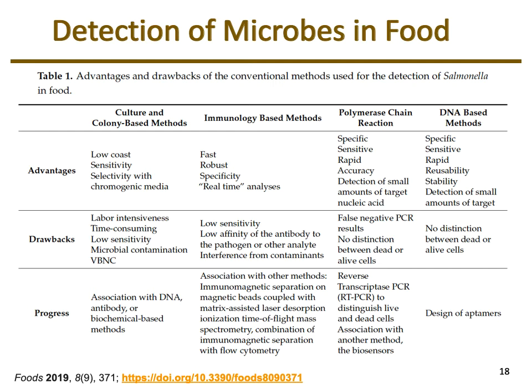So with immunological based methods, the advantages are you're going to get faster turnaround. You can also run a higher number of material. And because of the fast turnaround, you're almost getting real-time analysis of what's going on. And it can be highly specific. Some of the drawbacks is because of how these immunological-based methods occur, sometimes they don't have sensitivity. So we'll talk a little bit more about that in our next slide.